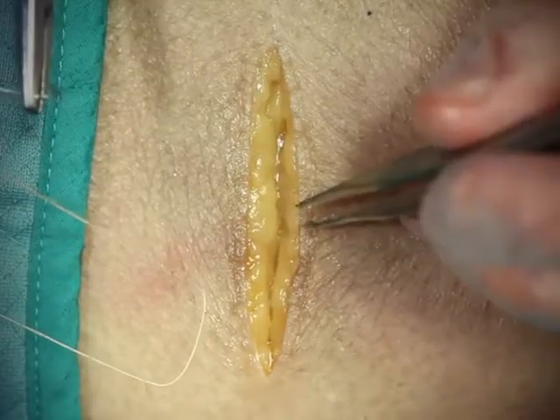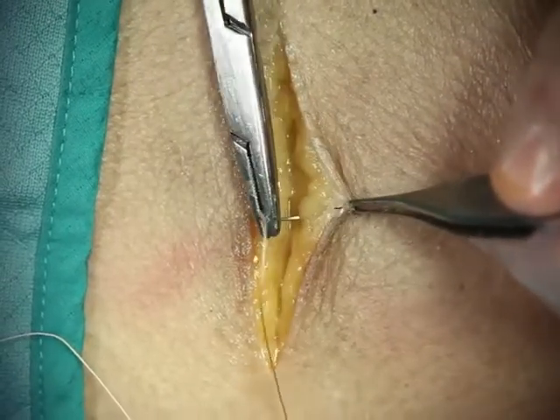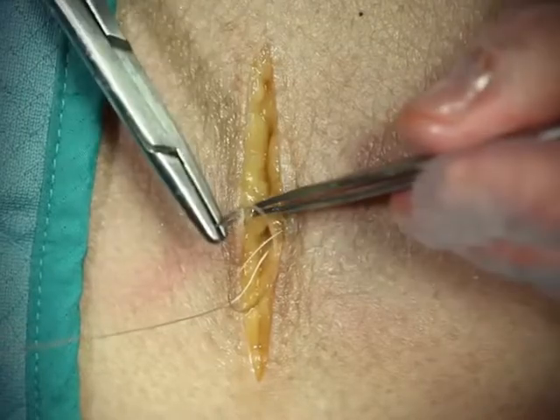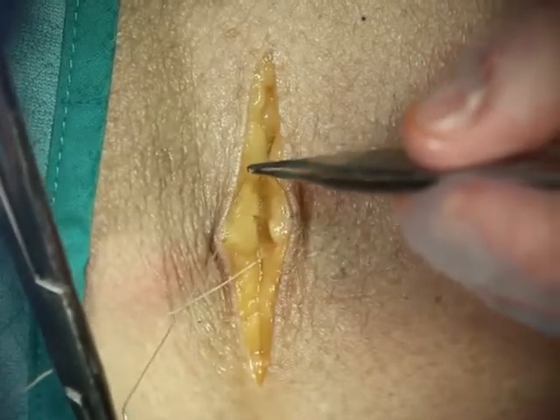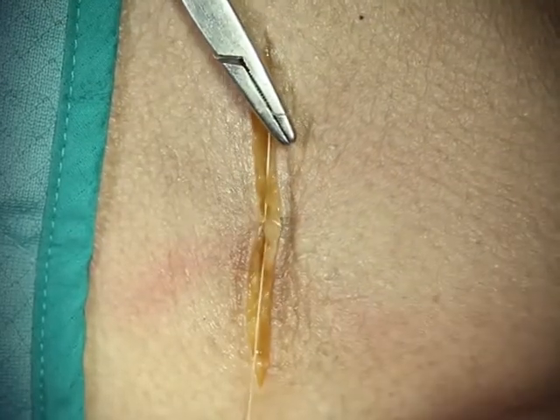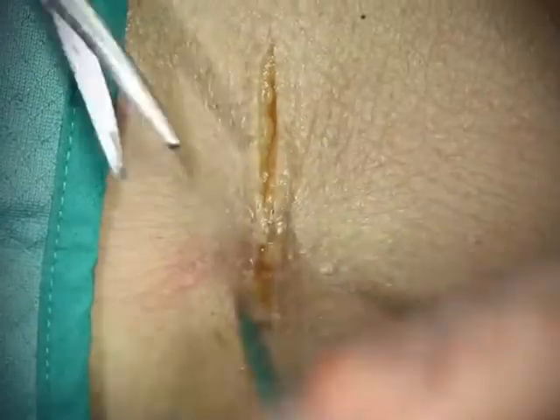Next is the simple buried suture. This will be the main suture you'll use when placing deeper sutures before putting your skin suture in. It's important when burying a suture that we start deep and go superficial, ending up in the dermis without buttonholing the skin. On the opposite side, we do the opposite — go superficial and then deep. If you want your knot to bury, it's important that both ends are on the same side of the loop. You can see here the loop and the suture coming out from the same side. As we tie this down with an instrument tie, we pull it along the length of the wound and that helps the skin edges come together, taking the tension off the skin so that when you do your skin closure, you can focus on approximation.